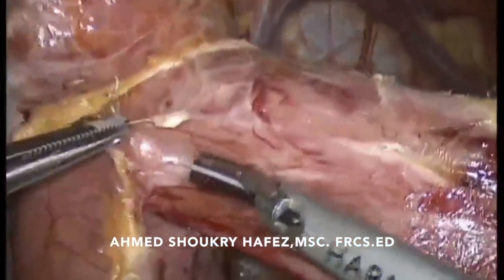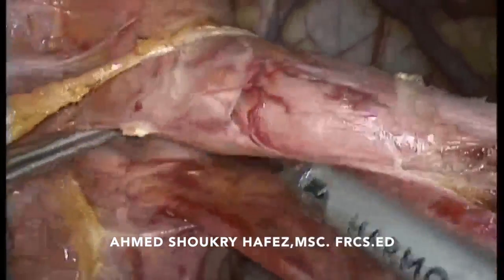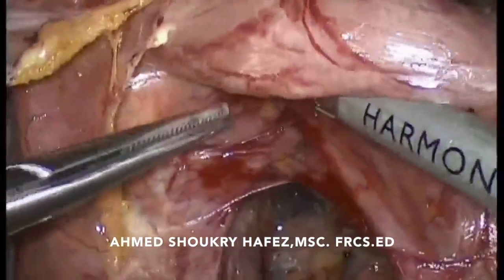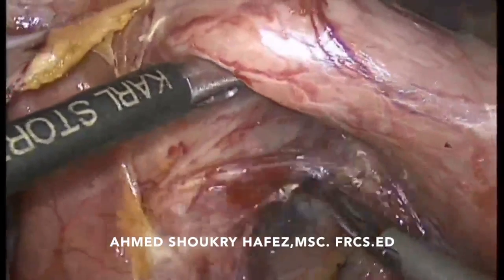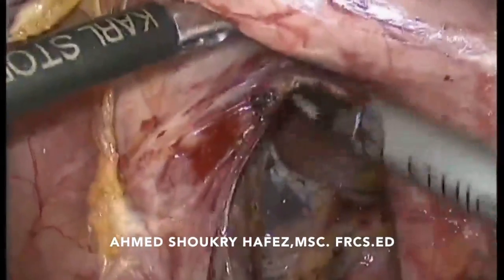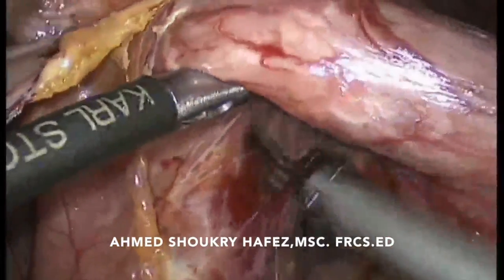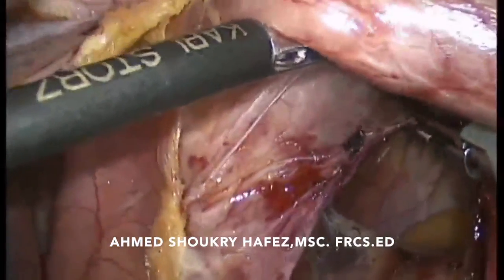Now we direct our attention to start dissecting the esophagus in its intrathoracic part, in its mediastinal part. And gradually, as we mobilize the esophagus, we dissect it away from both crura and the periesophageal tissue to gain esophageal lengthening, which is a very important aim.